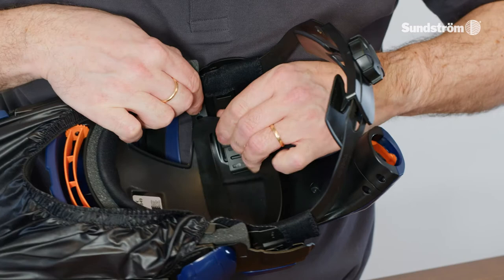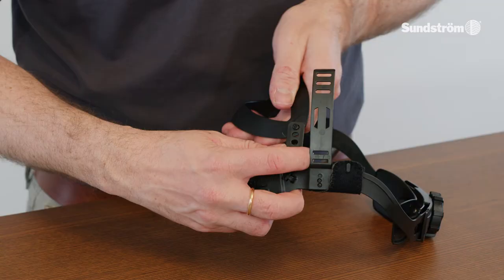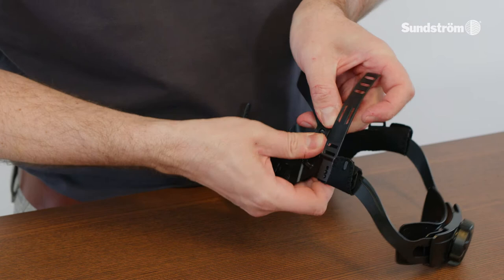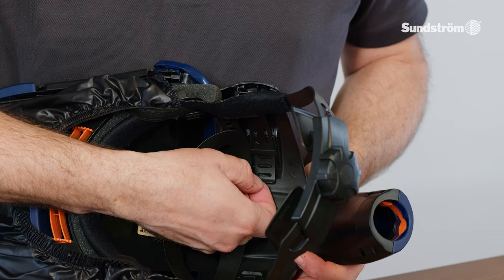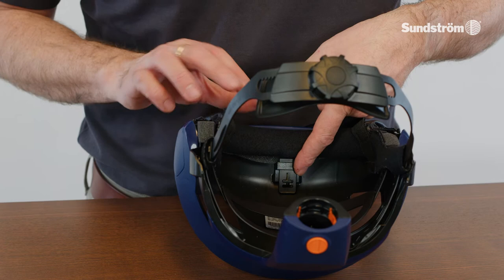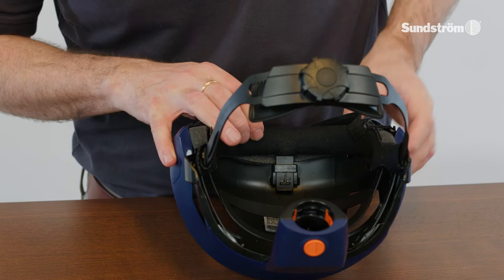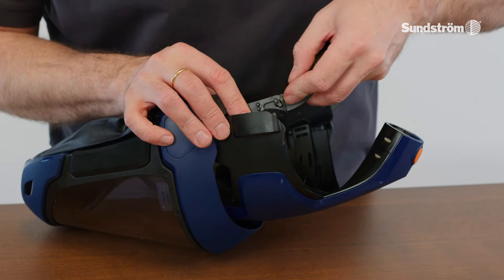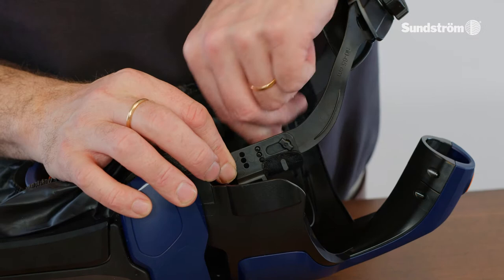Adjust head harness. There are different options: height adjustment, angle adjustment between visor and head harness, and width adjustment of the head harness.